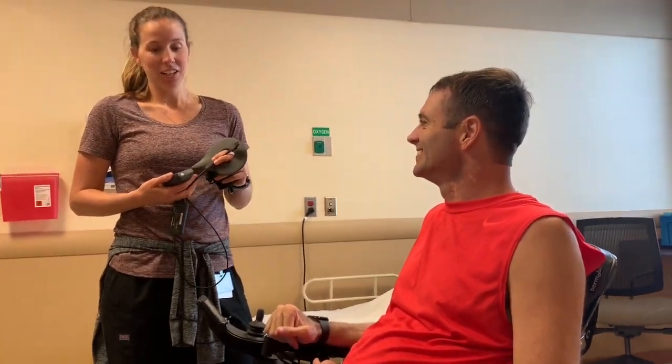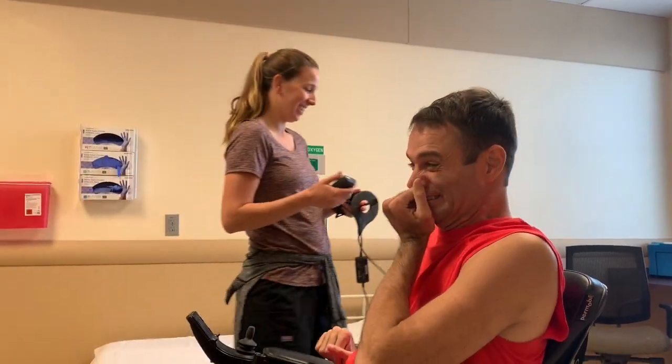Okay. And that will be a long experiment, so you will likely need to charge up again Wednesday night. But don't ever let it die. Right, because if you let the internal one die, it only has like a couple of lives in it. Right. And you ruin it. So many lives, yeah. And it's not like a cat, so not nine lives. Right. Not quite nine. So, that's that.